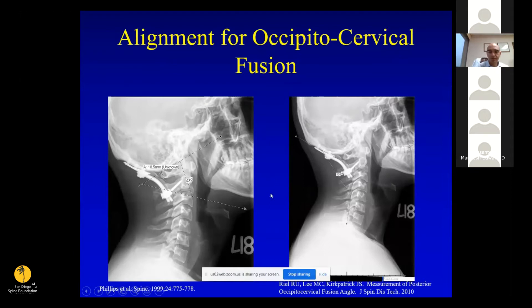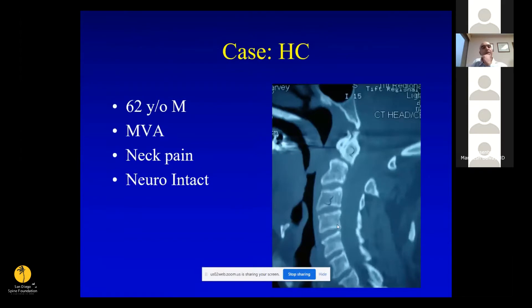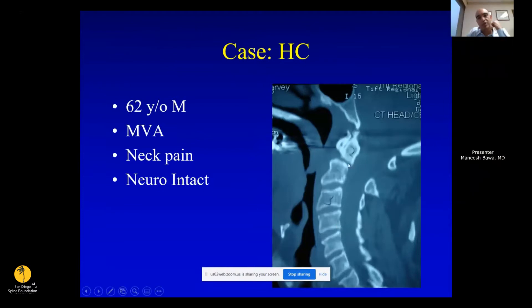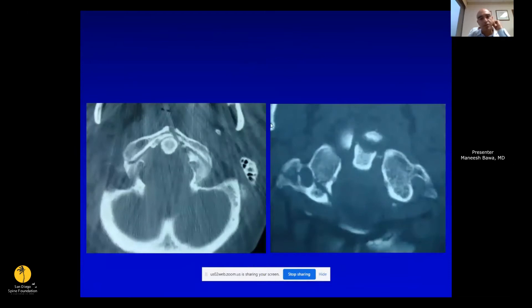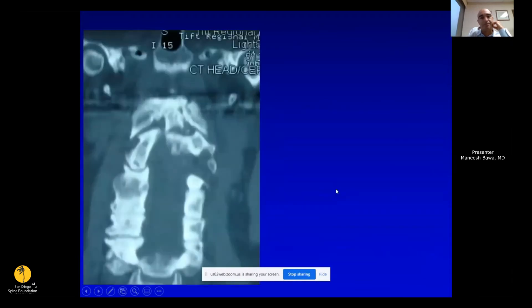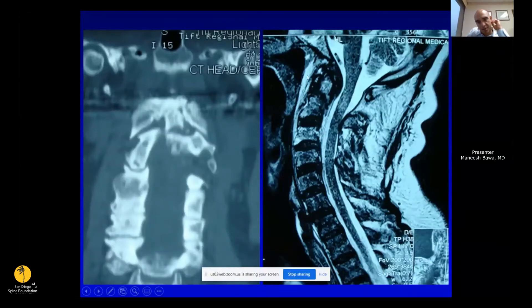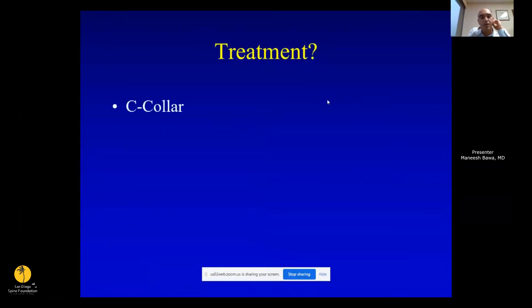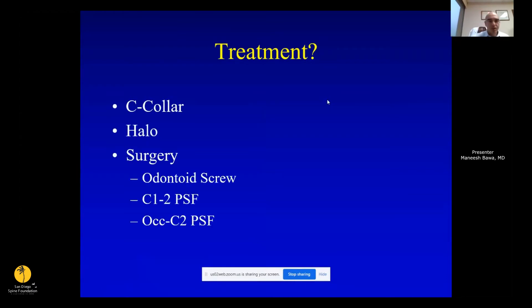This next case is a 62-year-old gentleman involved in a motor vehicle accident with a C2 odontoid fracture — possibly an acute-on-chronic injury. Axial CT through the C1 ring shows a burst or Jefferson-type fracture with a fracture anteriorly and through the transverse foramen laterally. Coronal view shows a fracture through the base of the dens. MRI shows some anterior fluid, but this is likely also a chronic non-union, suggesting a prior odontoid fracture. Treatment options include collar, halo, or surgery — this patient ultimately received an odontoid screw.